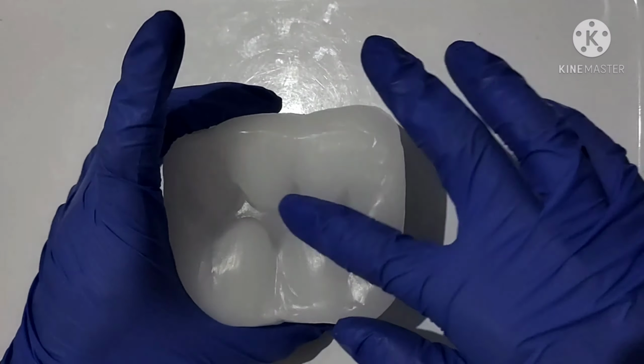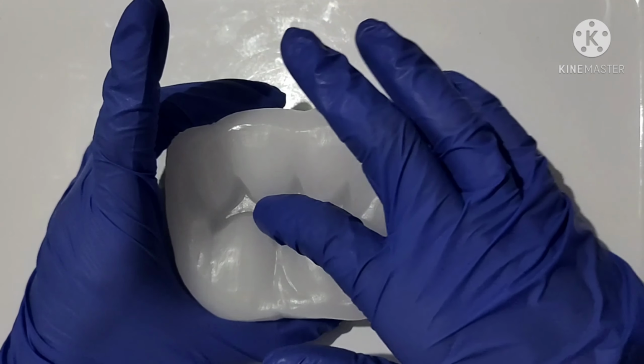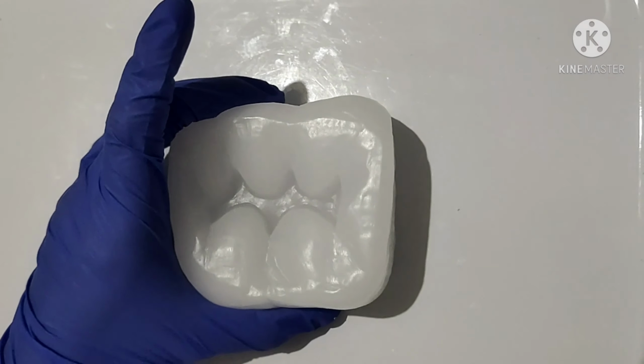And then the finishing of enamel walls. Again, it is rounded. And then the toilet of the cavity. The prepared cavity should be free from all debris. No disinfectant should be used to clean the cavity, and don't desiccate.